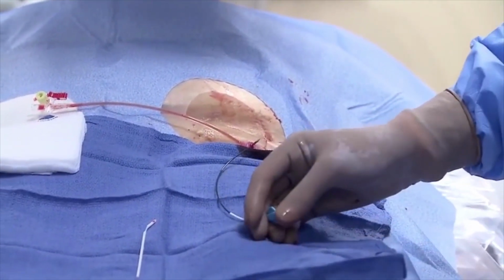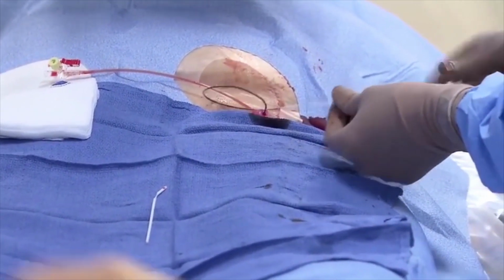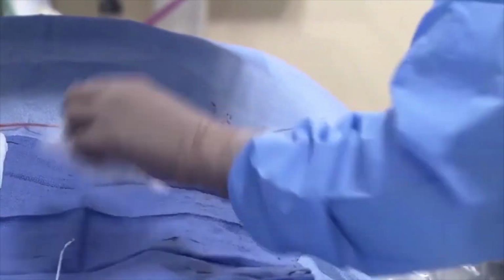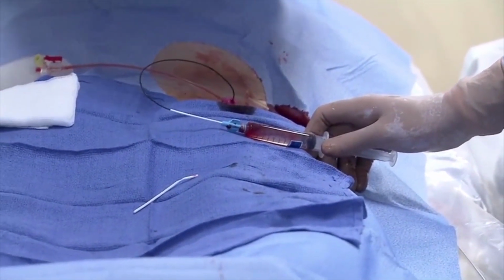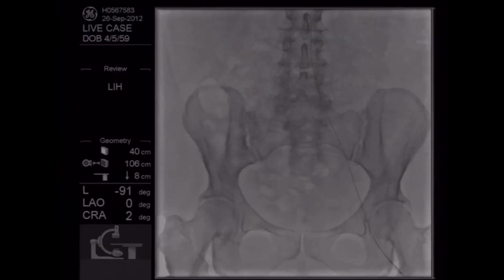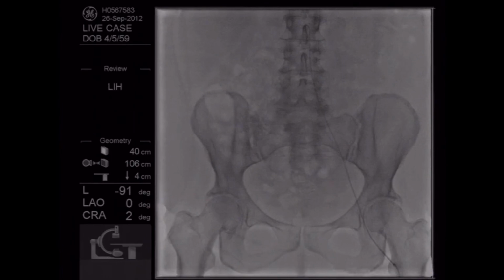And we're going to take a quick image of the pelvis just to verify that we haven't seen any changes in the patient's inflow, the delivery of blood to the legs through the pelvis. And so we're going to center up so that I can see all the way basically down to where we access the vessel. We're going to optimize our imaging setup here, and then we're going to go ahead and do a subtraction arteriogram.